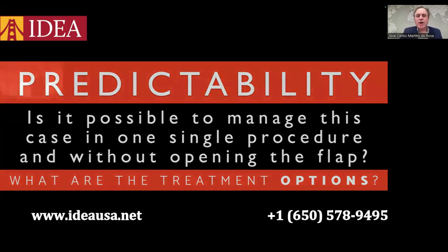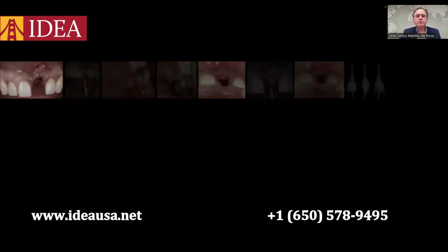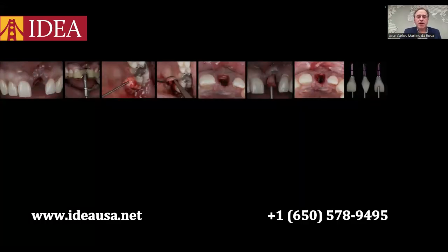Let me summarize what we did here. We performed the tooth extraction. We installed the implant fully guided. We harvest connective tissue graft from the maxillary tuberosity. We harvest also bone graft from the same donor area. And we performed the soft tissue reconstruction and the bone tissue reconstruction.